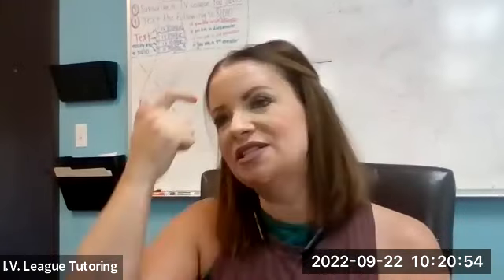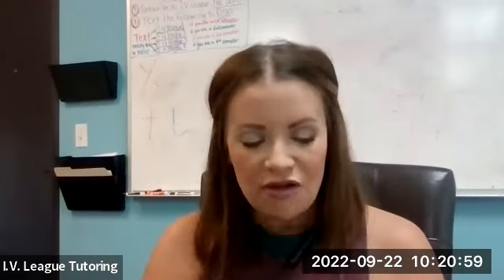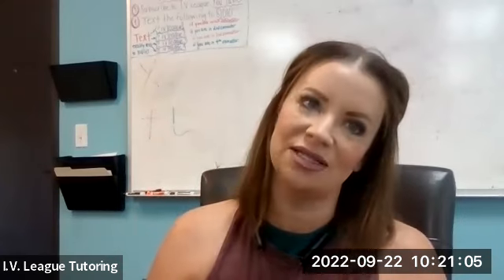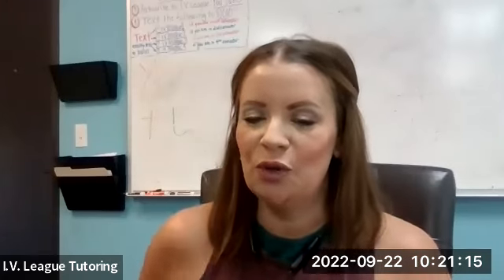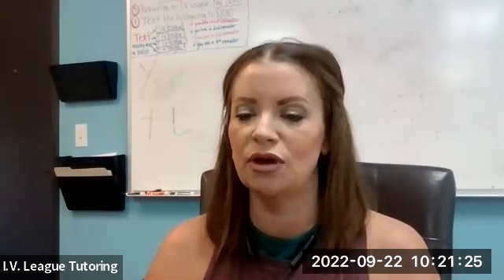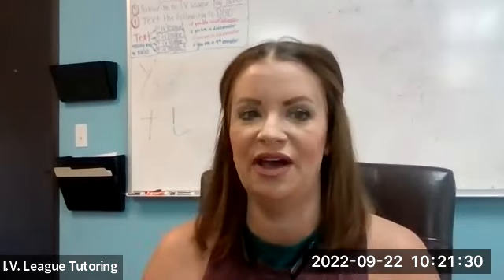All right. And then what does the T wave represent? Ventricular... Thank you for speaking. Ventricular repolarization, which means the ventricles are resting. Do you understand? Yeah. But even when they're resting, they're still working, so you'll see a T wave that's almost as big as the P wave. Imagine that. All right. So normal heart rate, 60 to 100. Normal PRI, 0.12 to 0.20. QRS complex is less than 0.12. And these are all going to be basically in seconds. Okay. So it's going to happen kind of fast.